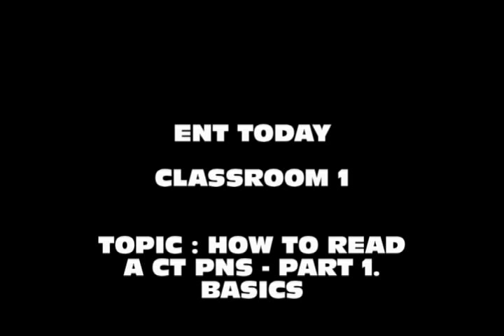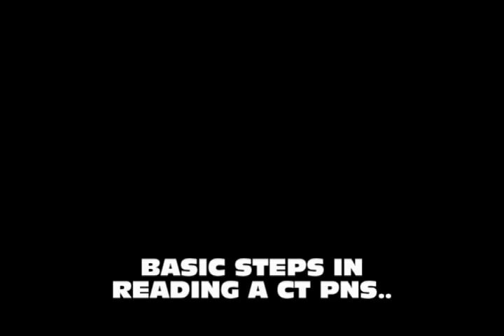Hi, this is Dr. Janikaram from India, and we are going to start ENT Today classroom. The first topic of discussion would be how to read a CT scan, basics. This is part 1. Basic steps in reading a CT scan of the paranasal sinuses.